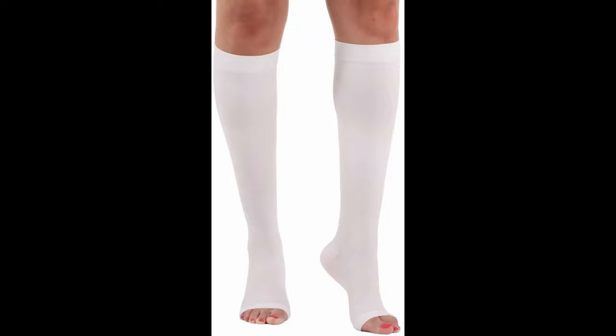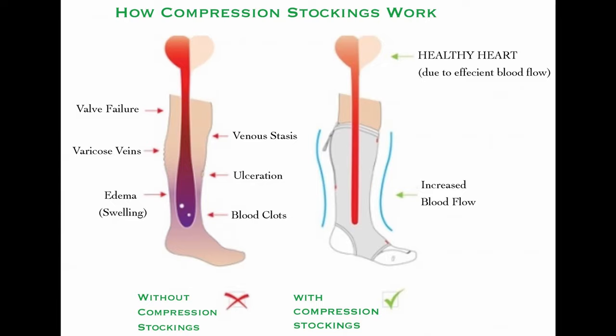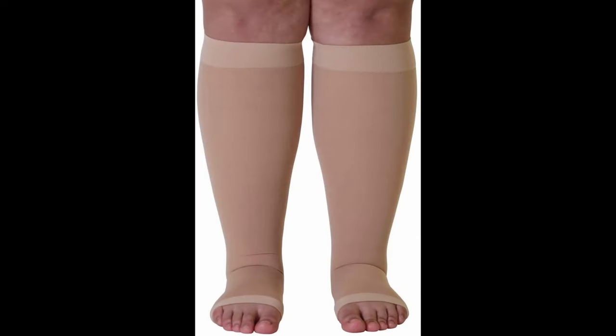In this video, you will learn about the plastic bag trick to put on compression stockings. Putting on compression stockings can be difficult either for yourself or as a caregiver helping someone else. One thing that makes putting on compression stockings difficult is how tight they are and how much friction there is between the skin and the stocking.